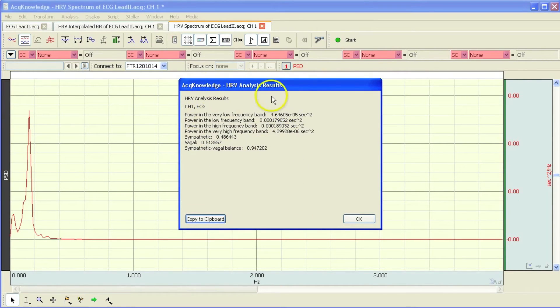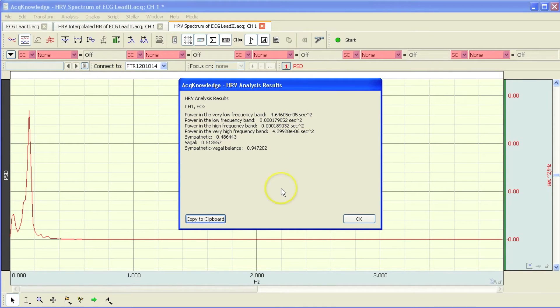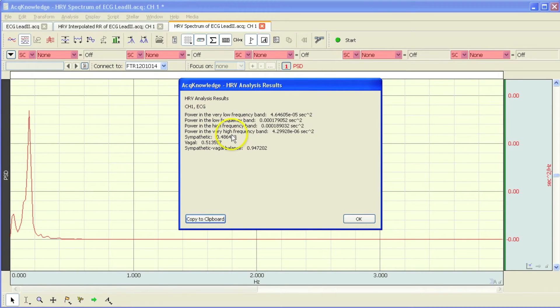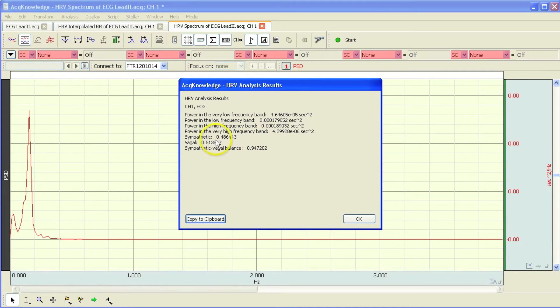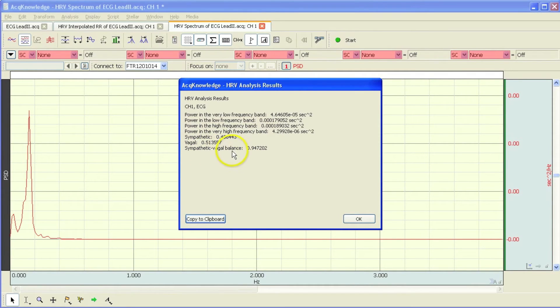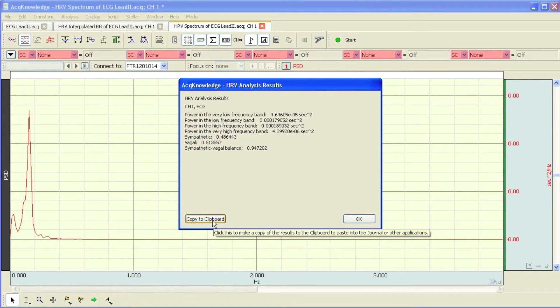These are the results from the analysis. The very low, low, high, and very high frequency values. Sympathetic, vagal, and then my ratio, sympathetic to vagal balance. I can copy these to the clipboard so that I can paste them into another file.